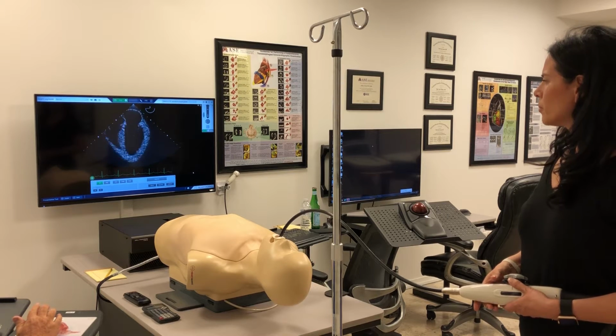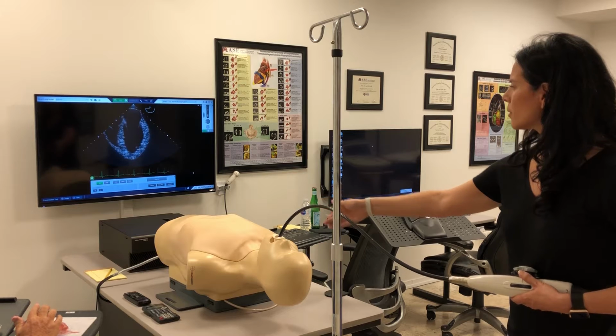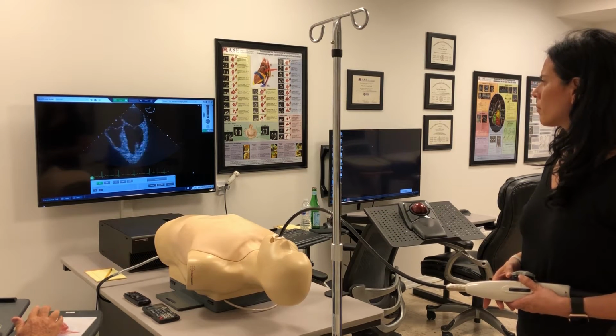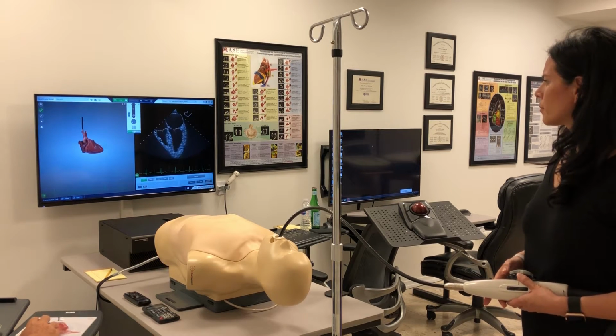Yeah. What do you think? Should I withdraw a little bit here? Just a little bit. Okay. And then at the same time, you might have to add in a little bit more retroflexion. Good. Let me just show you where you're at now.